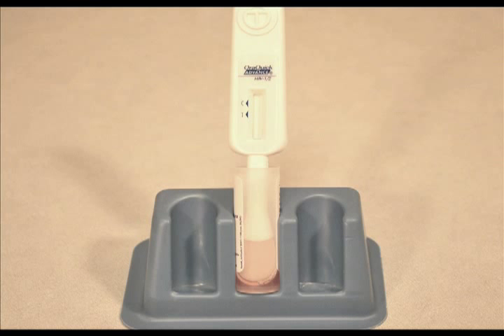A test is invalid if any of the following occurs. No reddish-purple line appears next to the triangle labeled C. A red background in the results window makes it difficult to read the result after 20 minutes, or any of the lines are not inside the C or T triangle areas.